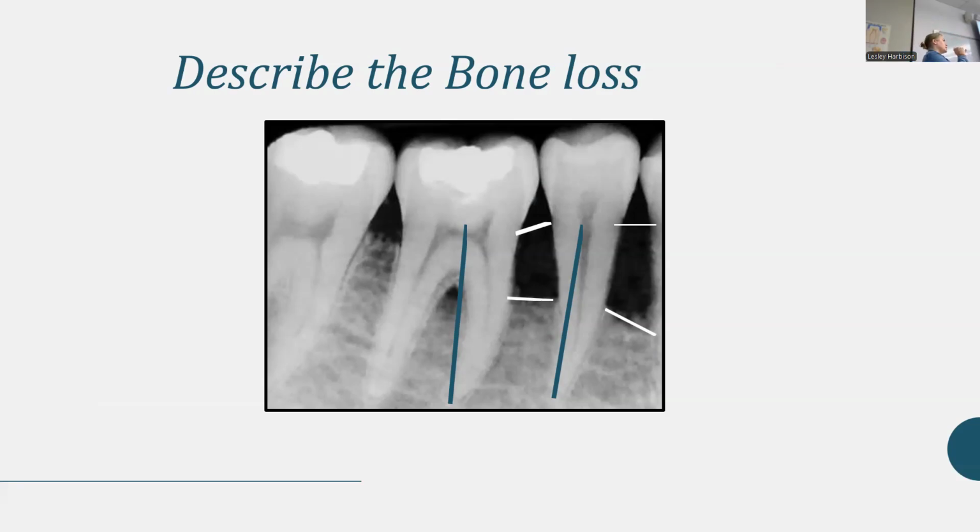So just look at the CEJs. It matters, but honestly, not every tooth is going to be perfectly in line, because people have all kinds of occlusal issues and teeth shift and rotate and come in. So CEJs are not always perfectly the same height across the board. So still, look really at the end result. Like here, this is not severe bone loss. You can still see bone back here. It's probably a multi-walled bony defect.